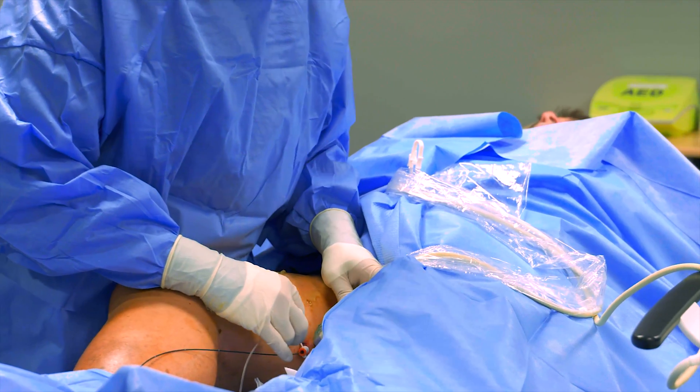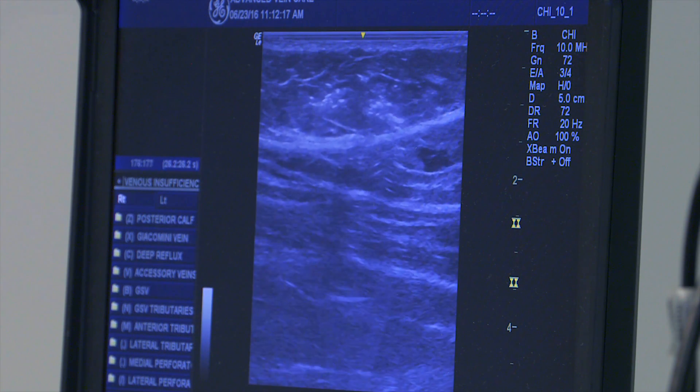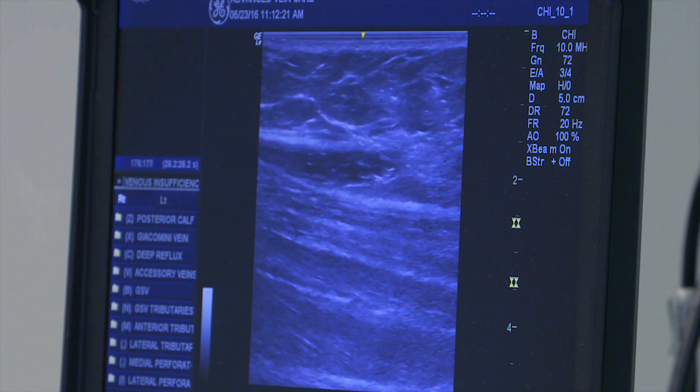After the tumescent anesthesia is injected, Dr. Faber will once again confirm everything is positioned correctly in your vein by ultrasound. When everything is in position, the ablation will begin.